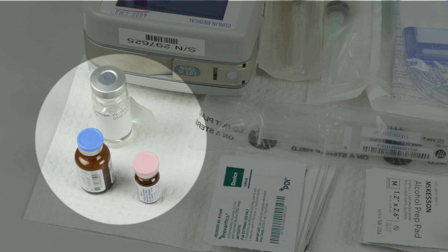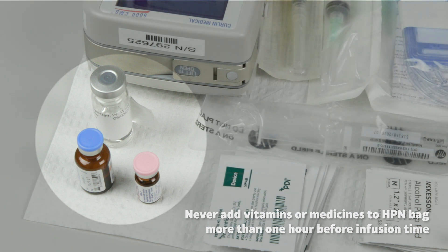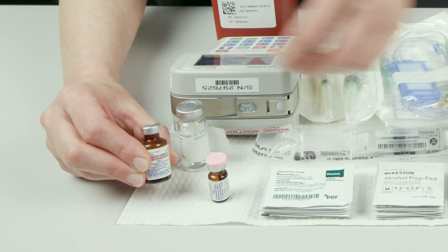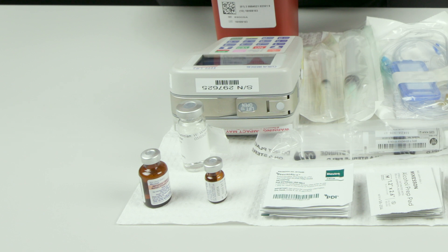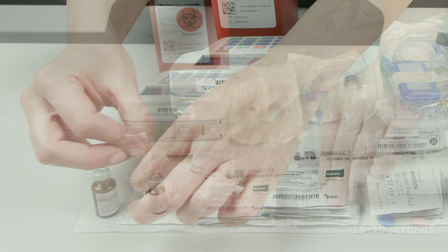Most HPN formulas require you to put vitamins or medicines into the bag just before the infusion begins. Never add vitamins or medicines to the HPN bag more than one hour before you start the infusion. Check the label on the vitamin bag to confirm the amount of vitamins to add to the HPN. To prepare the vitamins, remove the cap from each vitamin bottle. Scrub the rubber center of each bottle with a new alcohol pad for 15 to 30 seconds. Allow to air dry.